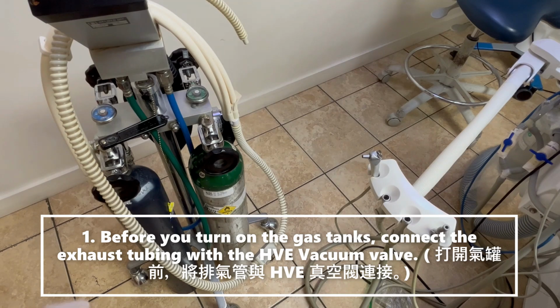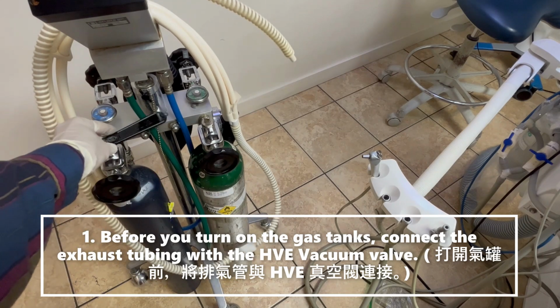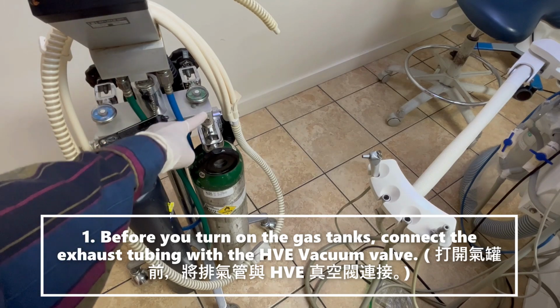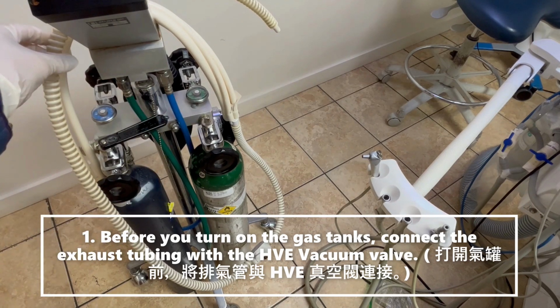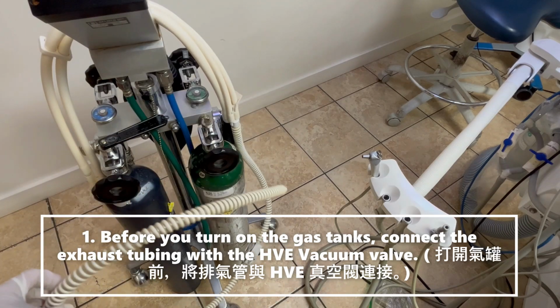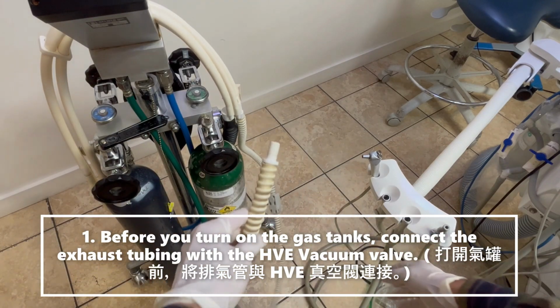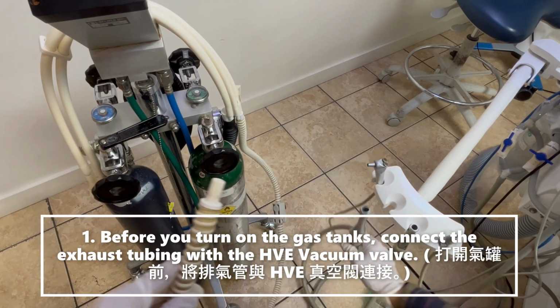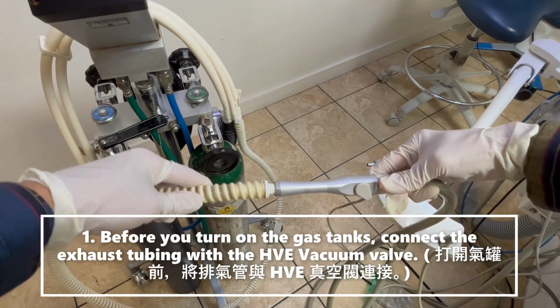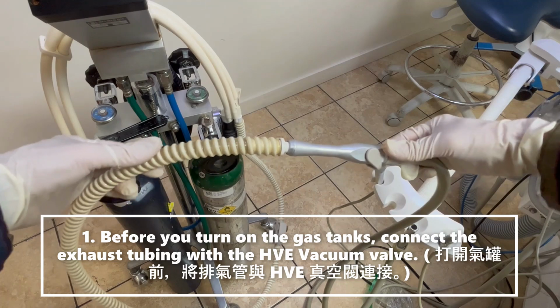Before you turn on the nitrous oxide tank and the oxygen tank, you need to hook up the exhaust system first. This is one of the exhaust systems that you need to hook up to your high volume vacuum system. So hook it up.